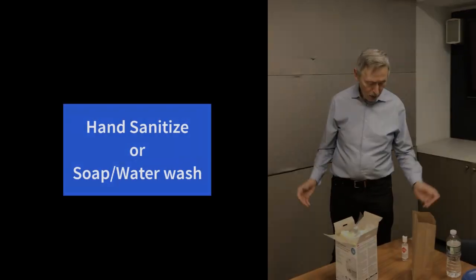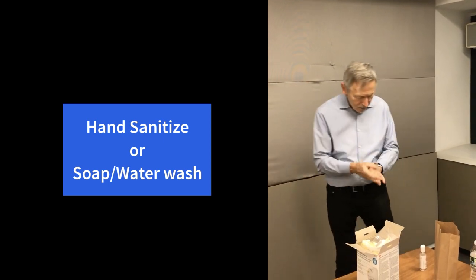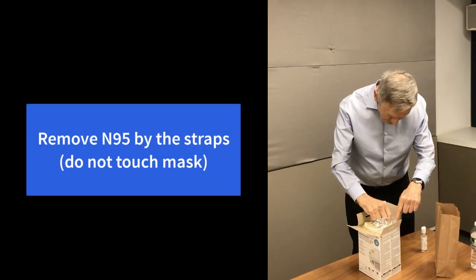So let's begin. The first thing you want to do is get hand sanitizer and thoroughly clean your hands. Even though the mask is brand new, it's a good practice to always hand sanitize before.